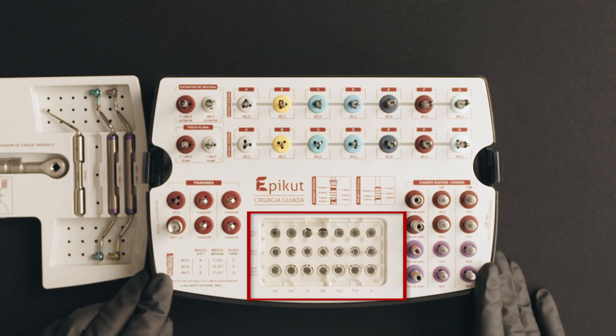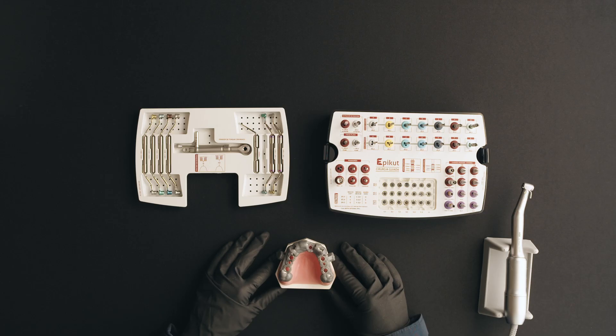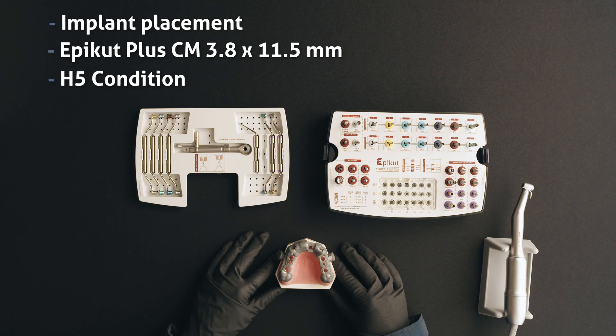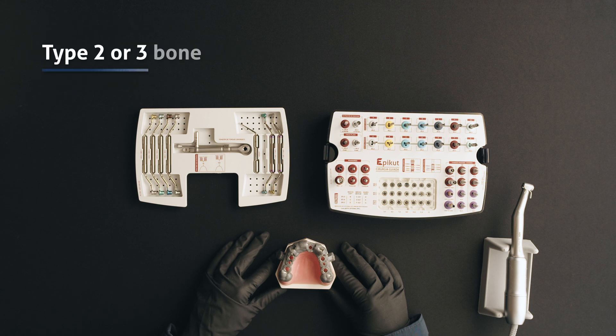The Epikut line provides a specific drilling sequence for each bone density, increasing clinical versatility. We will perform the drilling sequence of the Epikut Plus implant, Morse taper platform, 3.8 millimeters diameter and 11.5 millimeters length, in a simulation of medium bone type, also known as bone type 2 or 3.